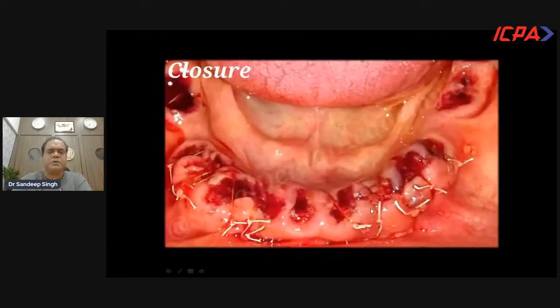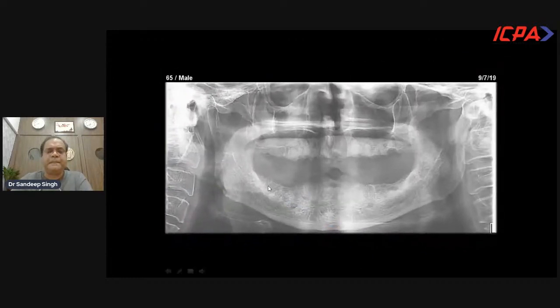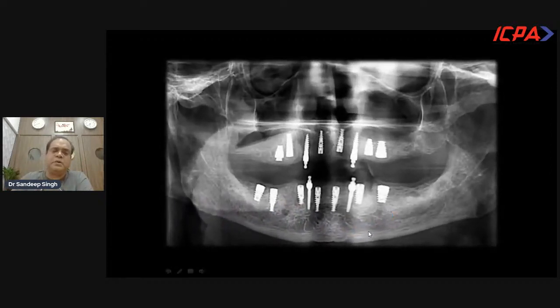So here also I used cytoplast PTFE sutures, and I am very fond of them. They are very patient friendly, with very little plaque formation on top of them. So no membrane, and you can see here this OPG after doing the socket grafting. Can you see this beautiful bone? Remodeling will happen, and it will develop into good bone. Within 3 to 4 months, I entered, and these 4 implants were to support the denture, and the rest of the implants were placed.